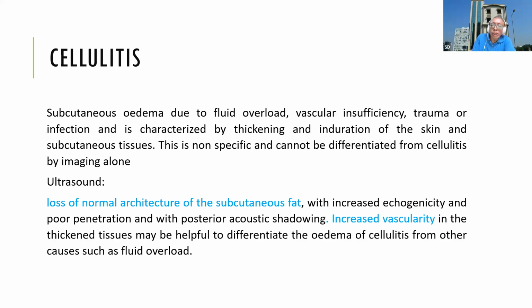Normally, subcutaneous edema can be due to fluid overload, vascular insufficiency, or edema secondary to trauma or infection. There is usually characteristic thickening and induration of the skin and subcutaneous tissue, but these findings are usually non-specific.